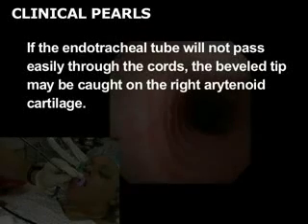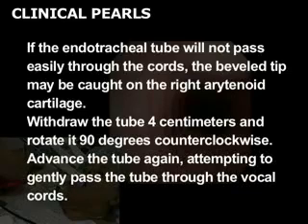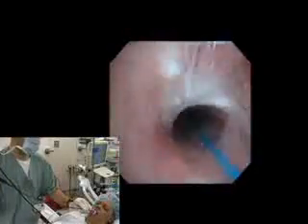If the endotracheal tube will not pass easily through the cords, the beveled tip may be caught on the right arytenoid cartilage. Withdraw the tube 4 centimeters and rotate it 90 degrees counterclockwise. Advance the tube again, attempting to gently pass the tube through the vocal cords. Gently advance the scope until the carina is visualized. Withdraw the fiber optic scope, leaving the endotracheal tube in place.